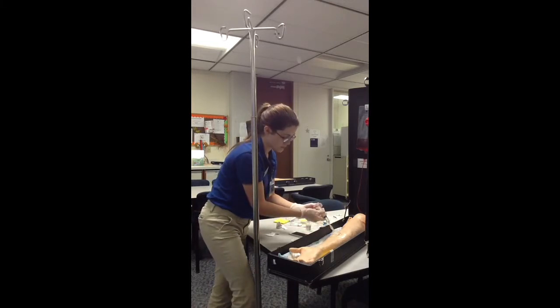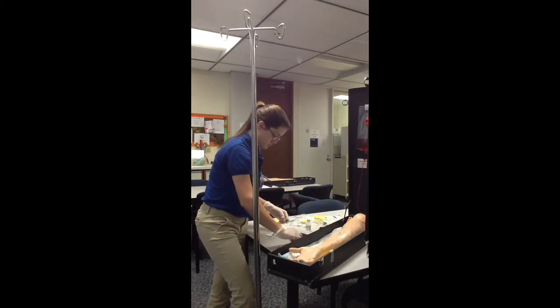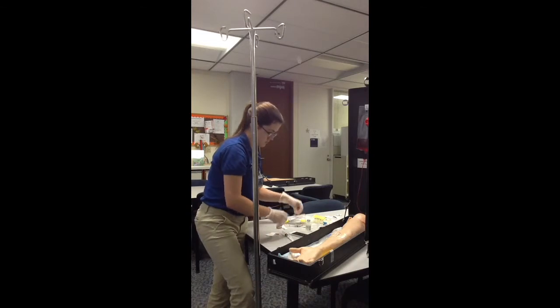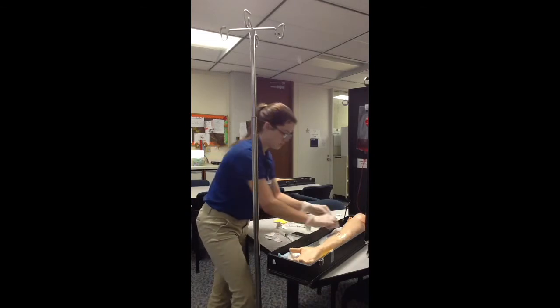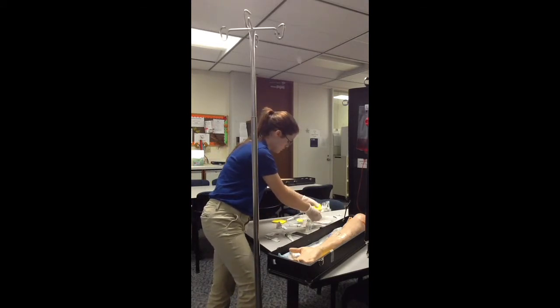So I'm going to aspirate, and I see a blood return. So I'm going to administer a push stop of saline, 3 milliliters. Okay. And I'm just going to clean the port one more time. And now I'm ready to connect my tubing.